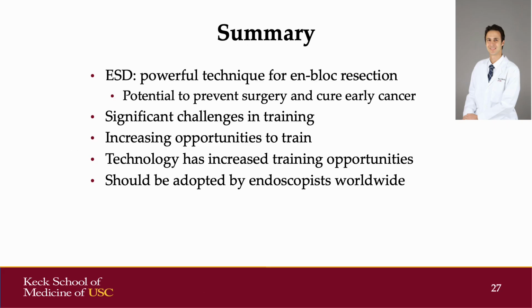In summary, ESD is a powerful technique allowing for en bloc resection of lesions of any size. It does have the potential to prevent surgery and cure early cancers of the GI tract. There are significant challenges to training. However, there are now increasing opportunities to train, and technology has increased the training opportunities. ESD now should be adopted by expert endoscopists all over the world.